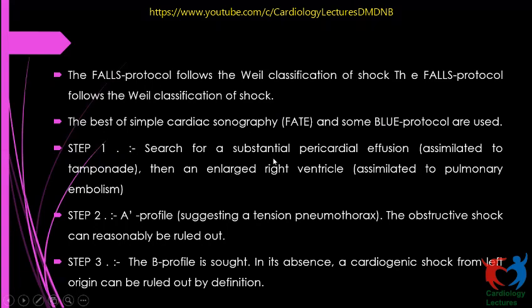Search for a substantial pericardial effusion assimilated to a tamponade, then an enlarged right ventricle assimilated to a pulmonary embolism. So whenever you have a patient with shock, the first step is to see whether there is a cardiac cause of the shock. So the FALLS protocol first step is to look for pericardial tamponade and to see the enlarged right ventricle for signs of pulmonary embolism.